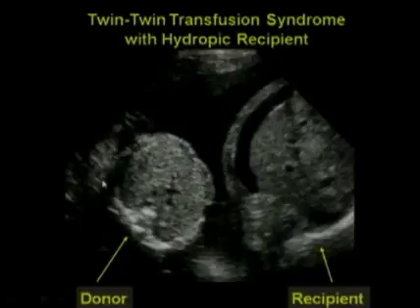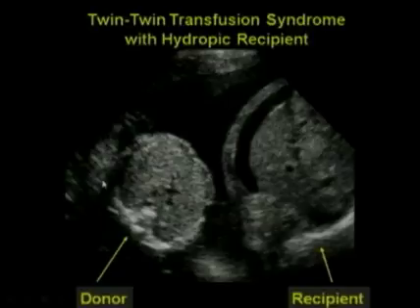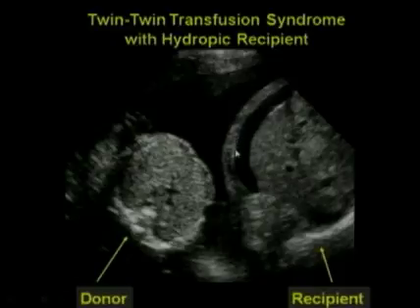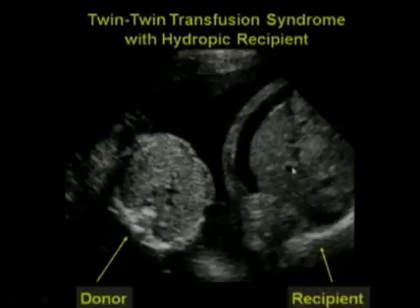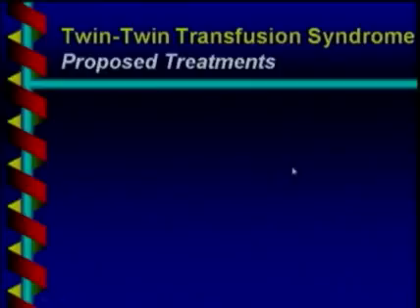Another indication of bad prognosis with twin-twin transfusion syndrome is when the recipient twin is hydropic. Here, small abdomen and big abdomen with all the findings of twin-twin transfusion syndrome, but on top of that there's ascites in the larger, recipient twin. This is twin-twin transfusion syndrome with a hydropic recipient — a very high risk situation.